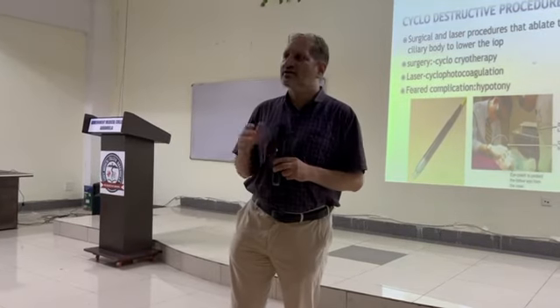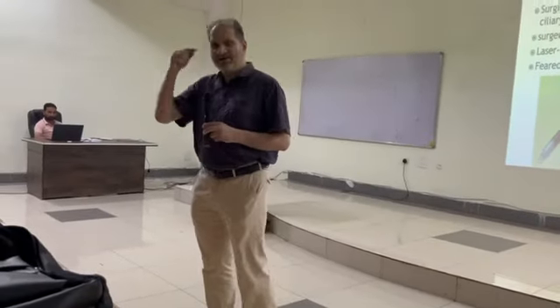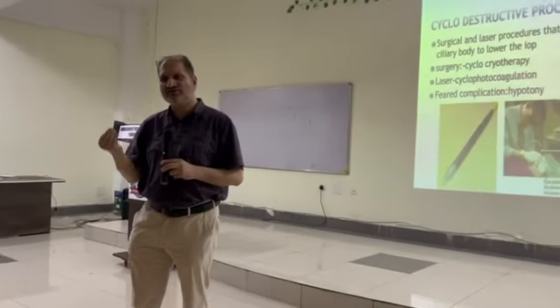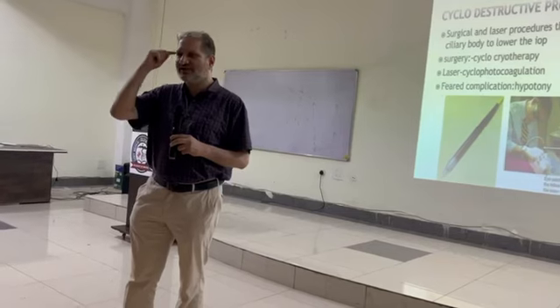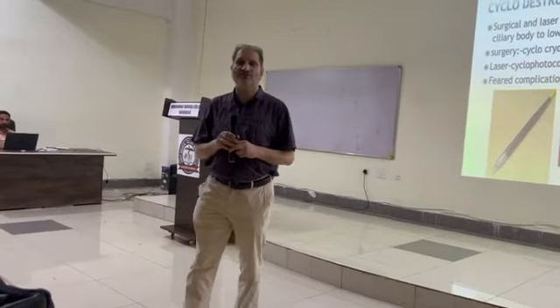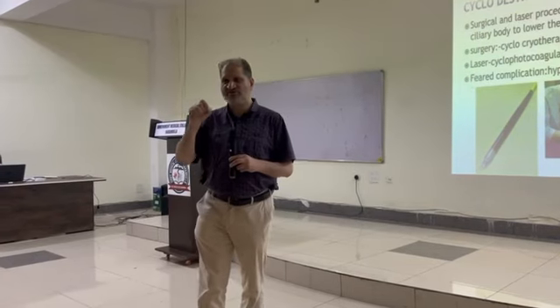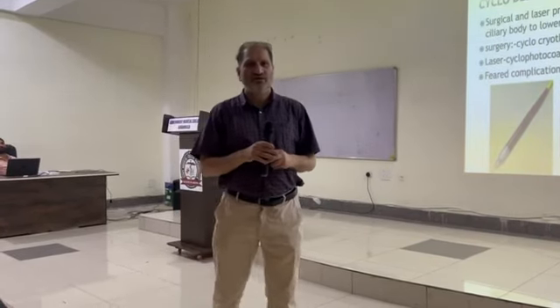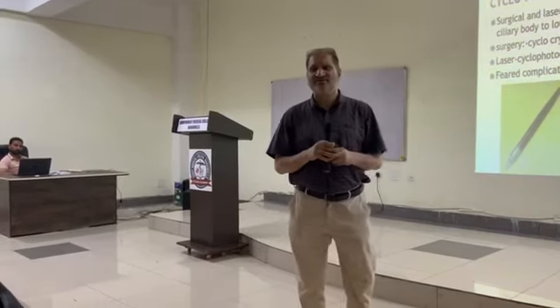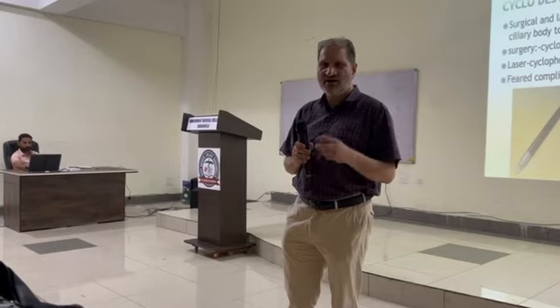So it's lasers. By laser. Yes. Right? By freezing. Freezing, yes. We will coagulate like this. Yes. Cyclophotocoagulation. That's called cyclo laser. Cyclo destructive. Photo. So we have cryo and laser cyclo destructive procedures. Laser.